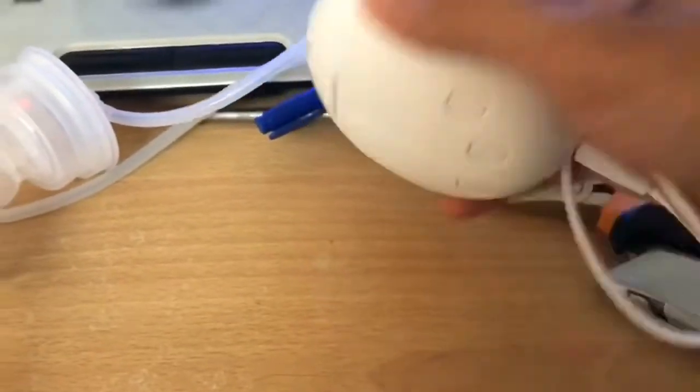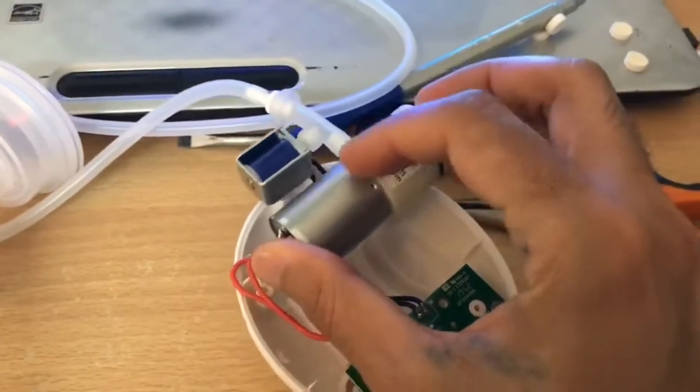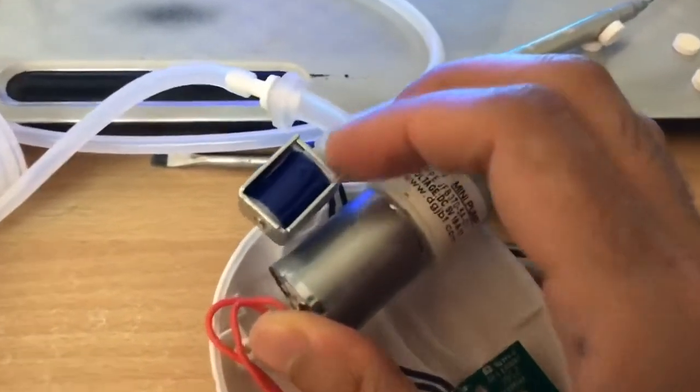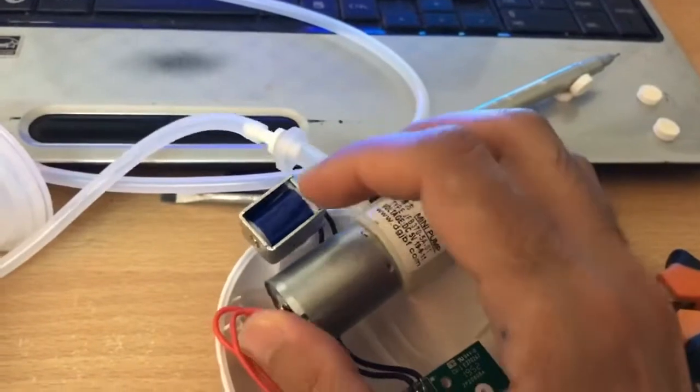So as you can see here, this one is the machine. This is the sucking pump — the suction. This one is the release machine. And this one is the motor or magnet that does the releasing.